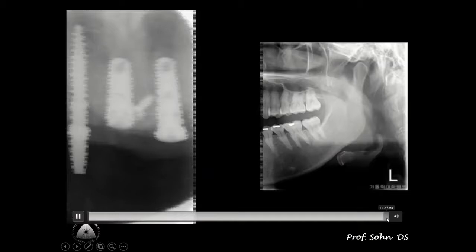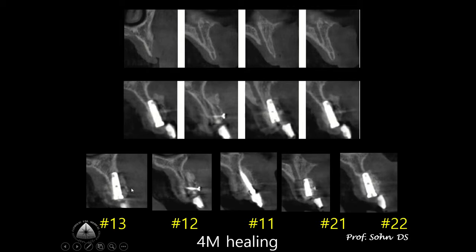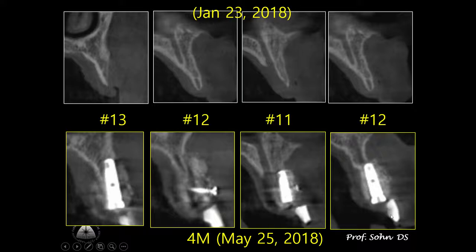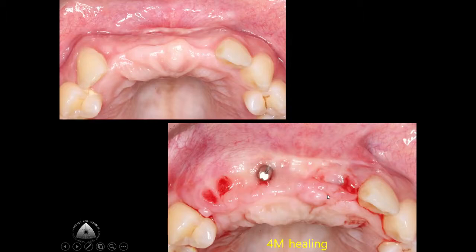Post-op x-ray and 4-month CBCT show favorable horizontal bone gain. Pre-op vs. post-op CBCT comparison demonstrates excellent horizontal bone regeneration seen around the dental implants. Pre-operative intraoral view versus 4-month healing intraoral view shows the favorable horizontal ridge augmentation that was achieved.